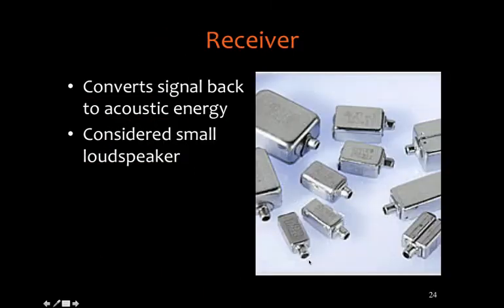One last comment before we jump out of this slide set, filling in with the little pictures of the receivers. Remember, the receiver in the hearing aid is that little loudspeaker. If these look like anything from the earlier slide set, they look just like microphones. Most receivers in hearing aids worldwide, regardless of the manufacturer of the hearing aid, are going to be a Knowles Electronics receiver.